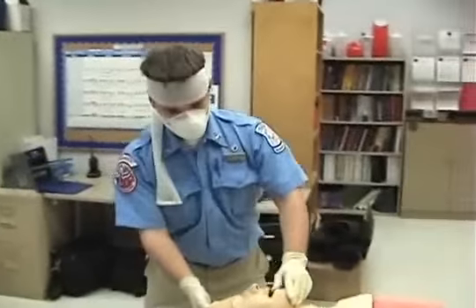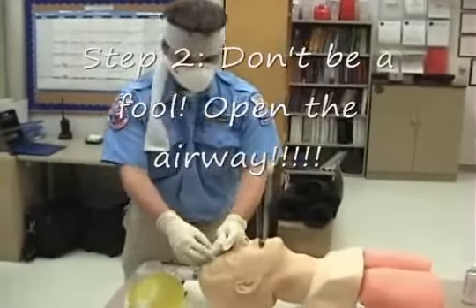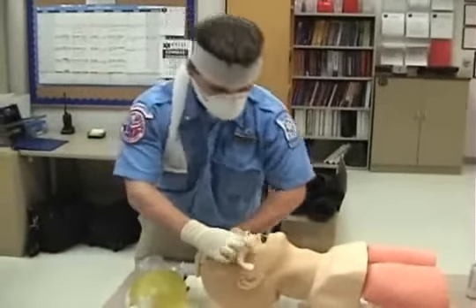After that, we're going to open the airway manually, and then size a properly sized oropharyngeal airway, measuring from the tip of the mouth to the tip of the ear, like that.